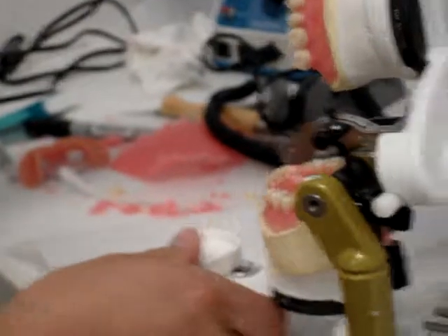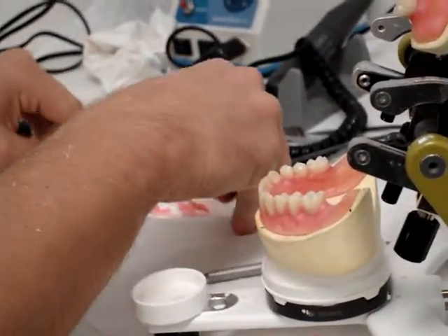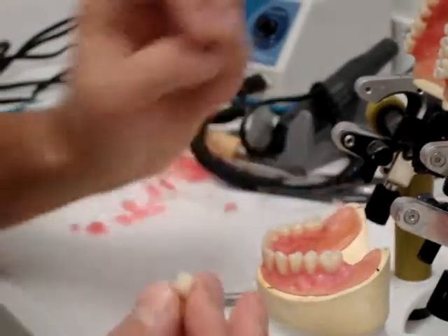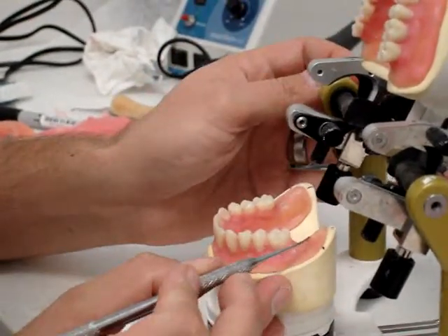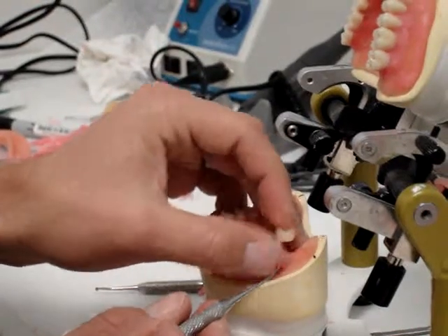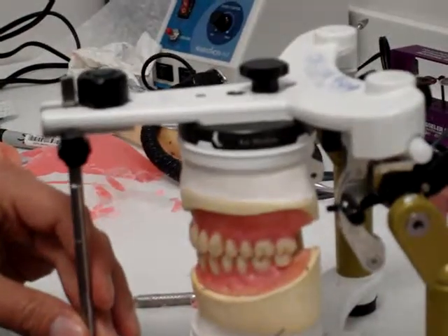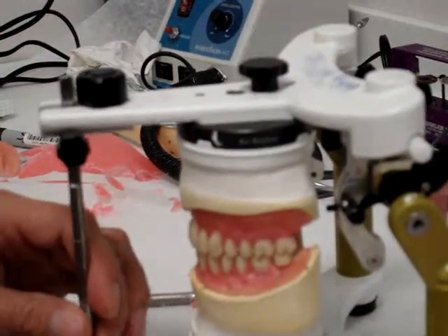The last thing we want to do as far as setting the teeth is set the mandibular second molars. These can be a real big pain. Number one, if this isn't thin enough — because you can see that's not a real big space for that to sit — you can have real problems. Or if your curve of Spee isn't big enough, then you can have issues with these.